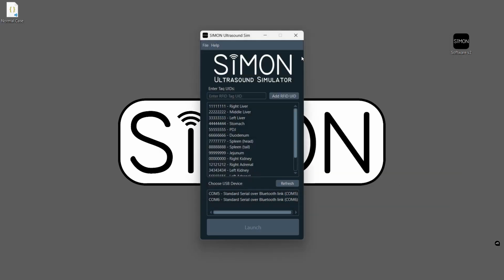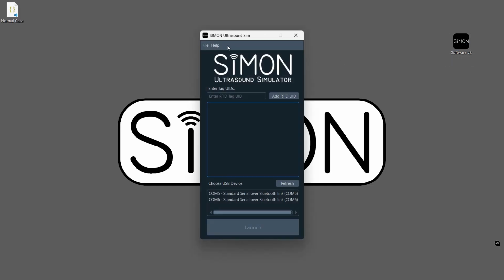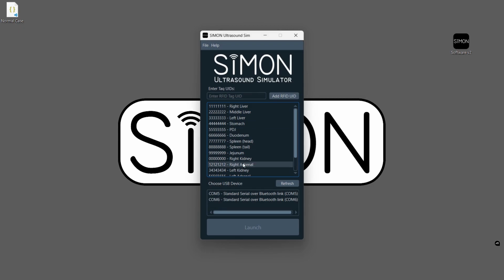Then, the next time you run the software, go to File, click Load, and then find the case where you saved it. Conversely, if you uploaded videos of a patient with metastatic disease, you can save this case as metastatic disease. Eventually, you can get to the point where you have a collection of different cases saved to your computer, which can simply be opened with the press of a button without having to upload videos each time. After saving your case, you are now ready to start using the simulator.